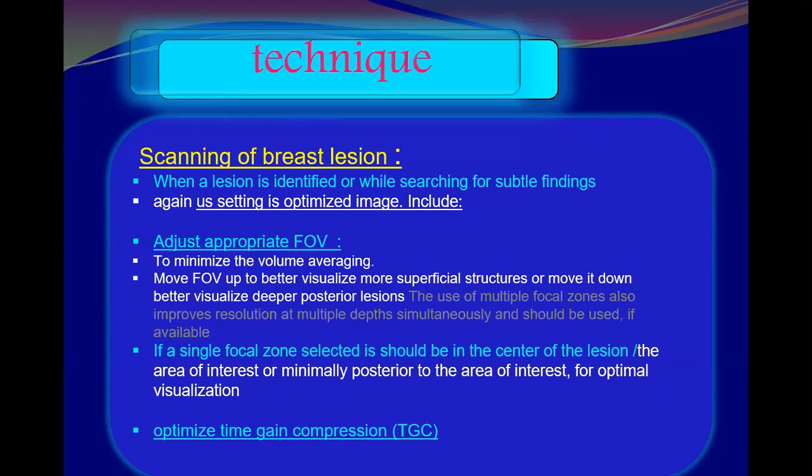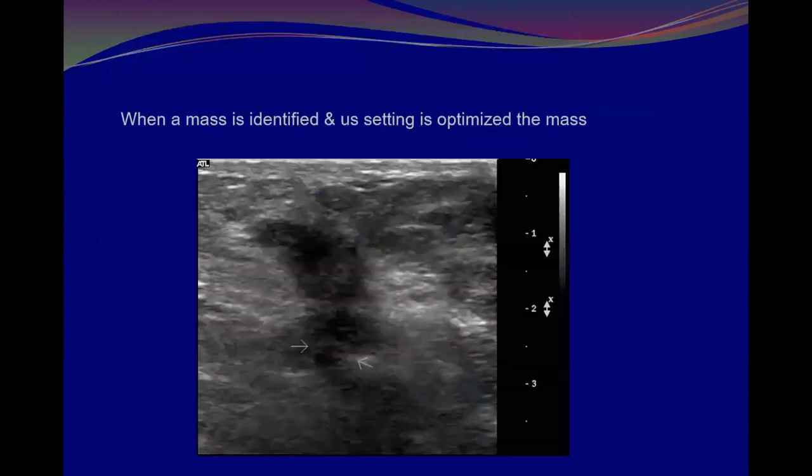And we need again to readjust the time gain to make sure the contrast is optimum, not over or under, to avoid artifact and to avoid eliminating the internal echoes within soft tissue lesions.